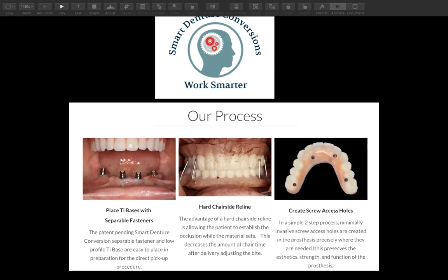The only thing you may have to do is take a wash and make sure that those temporary copings, they come in 2 heights, are not interfering and fulcruming on your denture. You want to make sure it's fully tissue supported and not hitting on those temporary copings. So yes, you could still take a wash, relieve that a little bit, but pick that up.